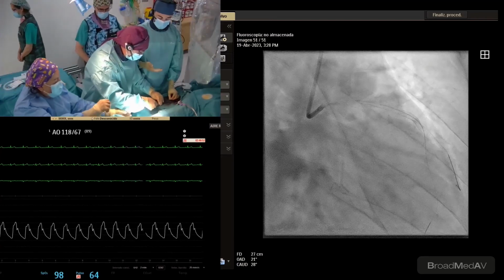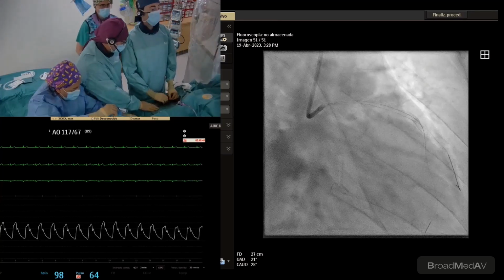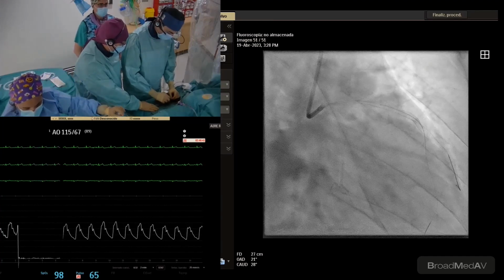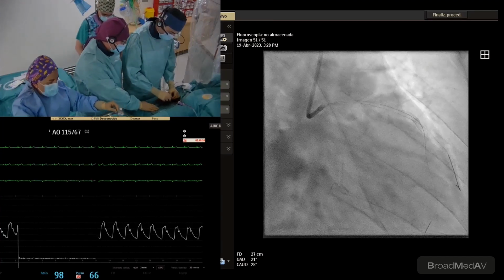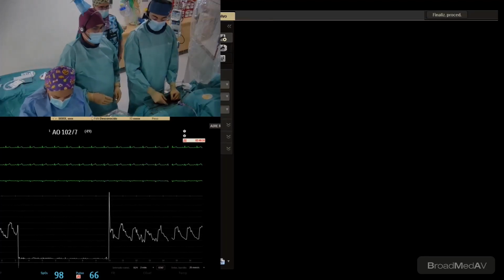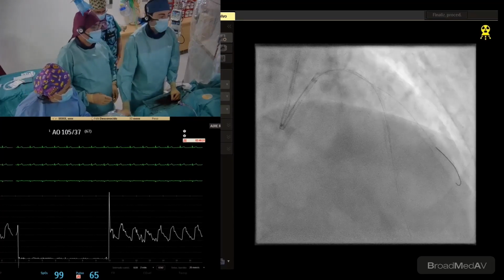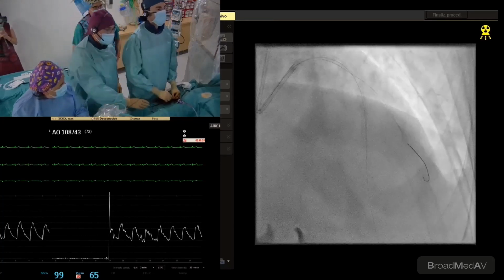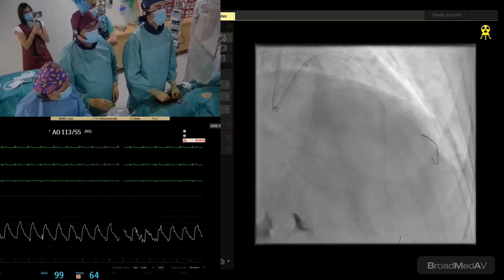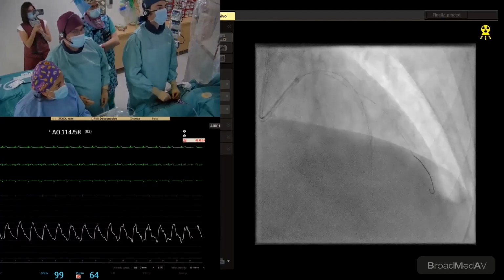We did intracoronary imaging, OCT, and in the OCT we didn't see severely calcified lesion, severe neoatherosclerosis or calcified neoatherosclerosis. So we thought that just with dilatation with an NC balloon or a cutting balloon would be enough, and we succeeded. So this is the thing. We prepared everything just in case of complex PCI, as this is not complex, but we prepare everything just in case. But now I think that the patient is the most important thing, and dilatation with balloon was enough.